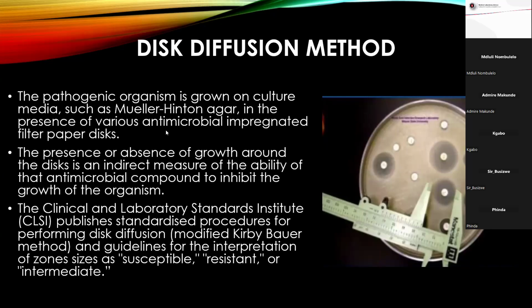There are other methods which can be used in those organisms, which I have indicated. The commonly used one within the region where we are is the CLSI guideline. It has the procedure on how to do AST on different organisms and how you can interpret whether resistant or susceptible per antibiotic disc. Those antibiotic discs, those white discs, have a known concentration of antibiotic impregnated. They're dried, commercially prepared.